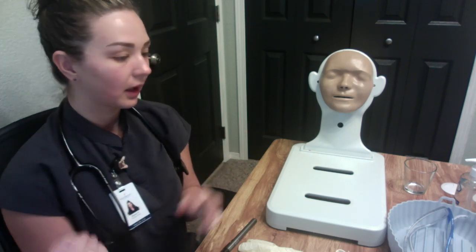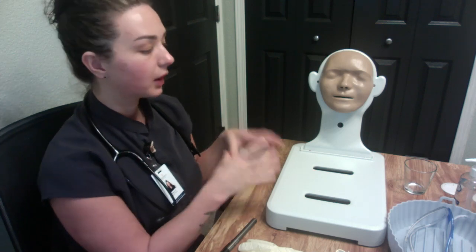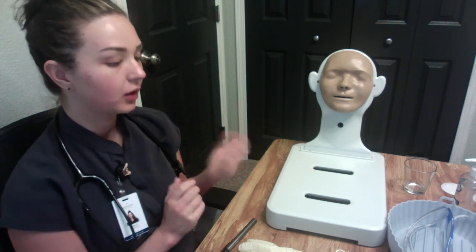Can you go ahead and verify your first name and your date of birth, while I verify it with our armband? Okay, great. So first things first, we always want to make sure that we are verifying the provider's orders. Ideally, I should have done this before I entered the patient's room. But yeah, we want to first start by explaining the procedure to the patient.